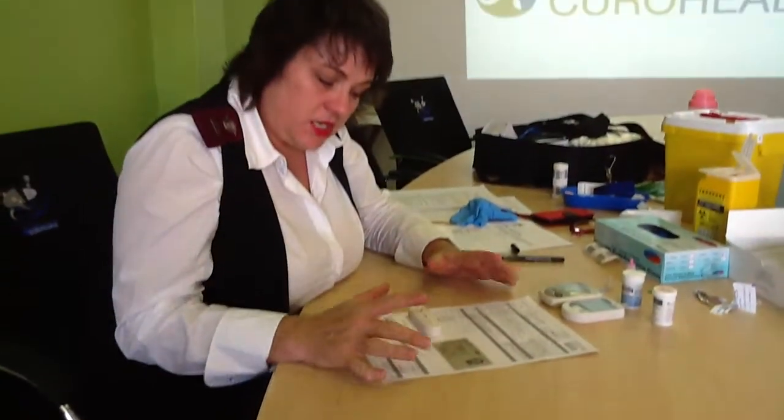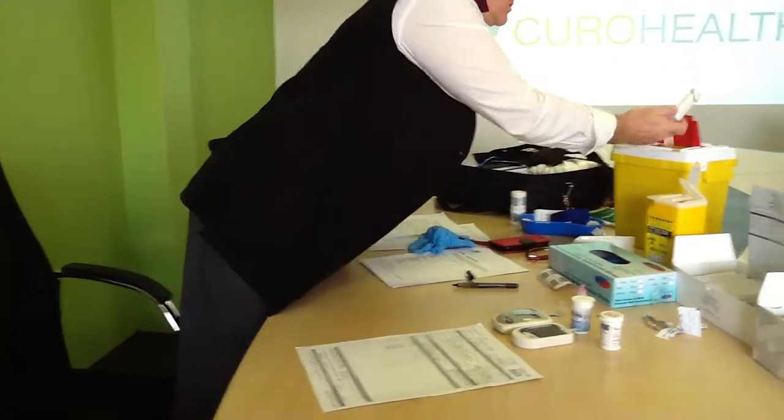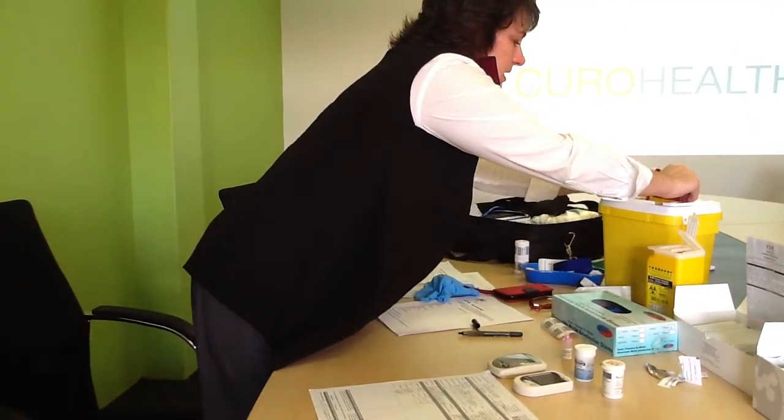Once you have done that procedure, you can say to the client, thank you sir, there's your identification document. You can take your rapid strips and you can throw them into your big yellow medical waste drum that Karen will supply you with. Please do not leave these rapid strips with your clients. These are medical waste. Don't let them say, my daughter's busy with a task, can I use that please? No, it is medical waste. It goes into the drum and Karen will arrange for the couriers to come and collect it from you, nicely bound and properly sealed when it is full. So that procedure is in place for you to make sure your medical waste is managed.